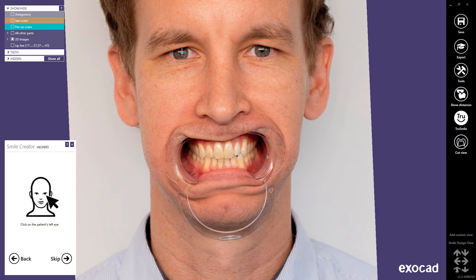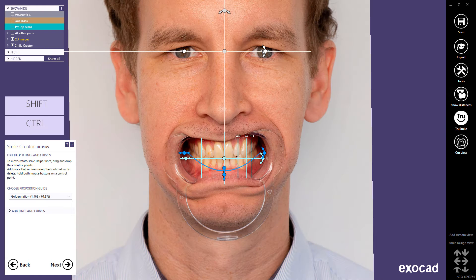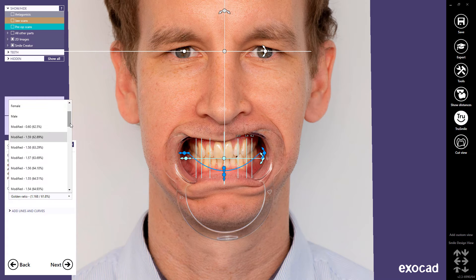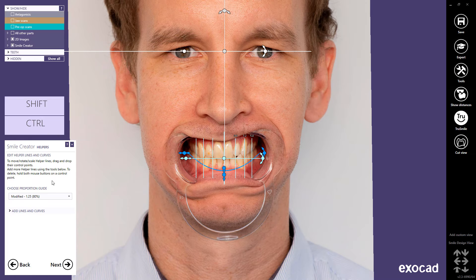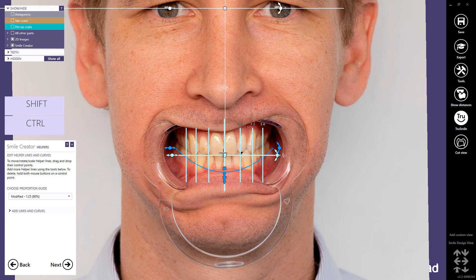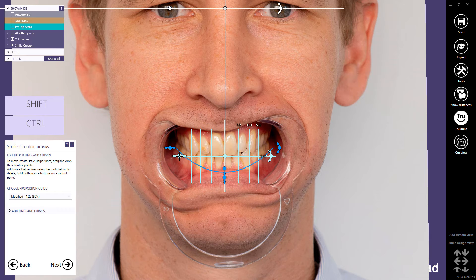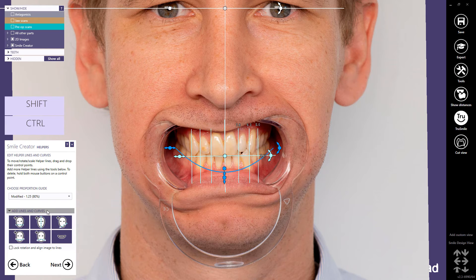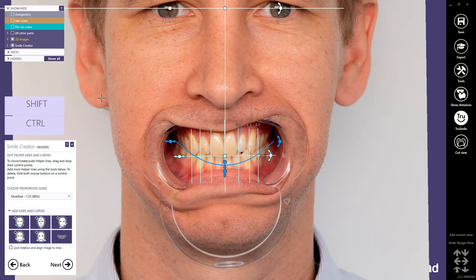In the helper step, it's important to start by clicking on the patient's right eye, then click on the patient's left eye. By default, the golden ratio will be shown. You can modify this ratio by choosing a different proportion guide from the drop-down menu. Helper lines can be moved, scaled, and rotated by dragging and dropping their control points. You can also add more helper lines using Add Lines and Curve. Smile curves can be added to determine the boundaries of the smile and can be adjusted according to the patient's lip line.